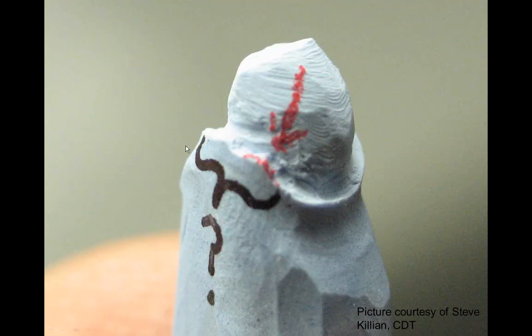Now, Steve is really good. He'll grab something like that, and he will trim this thing out, mark it all up, make big red arrows, it's hard not to notice, and get it back to the doctor with the question of, what do you want me to do with this? You can see this is problematic, and we're going to have issues right here.